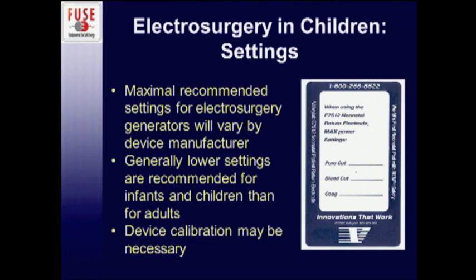So they should be calibrated individually, and one device from room to room may be different from each other, to provide a maximal current of 300 milliamps. And that's what's recommended for these particular electrodes for children in this size.